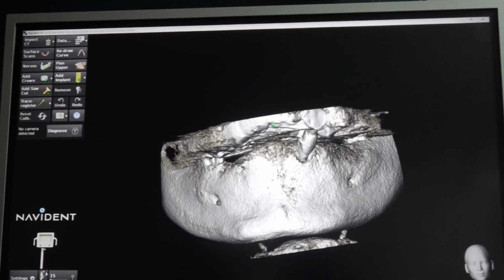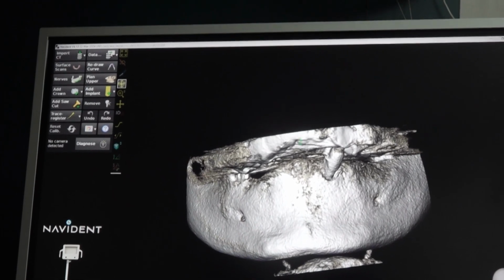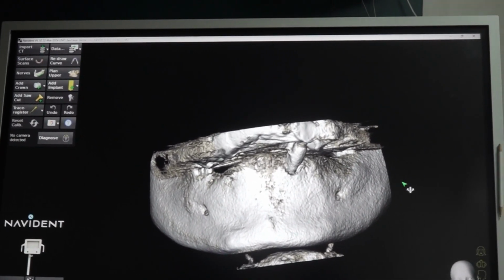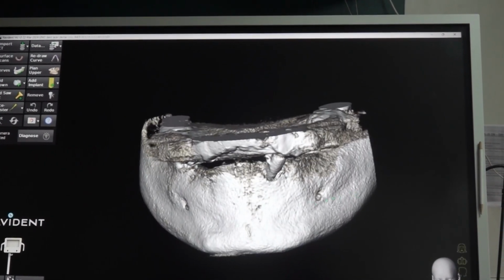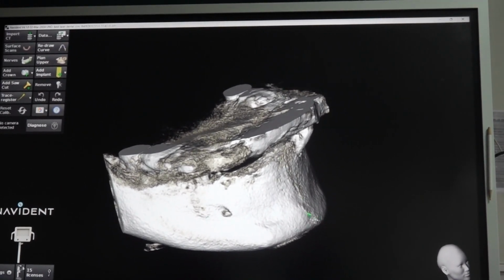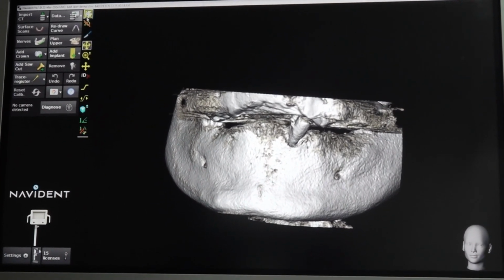So we have to bring the lower incisor position still more down. So we have to do a lot of alveoloplasty. In all this kind of vertical maxillary excess patients, the anterior mandible height will be very low. This height also will be very low.